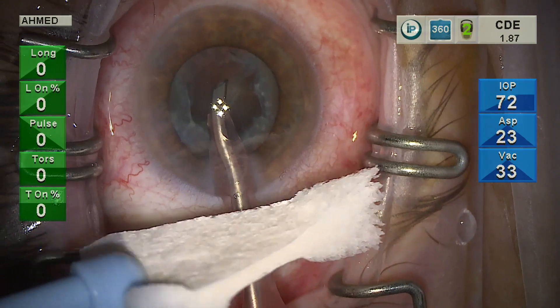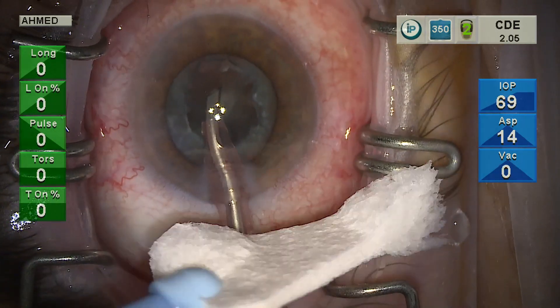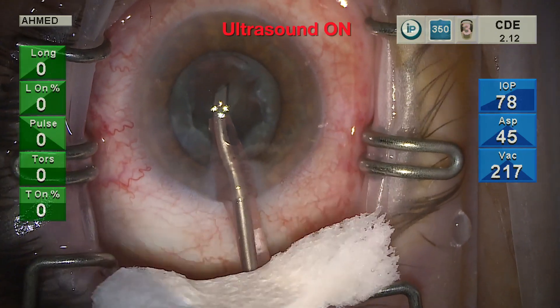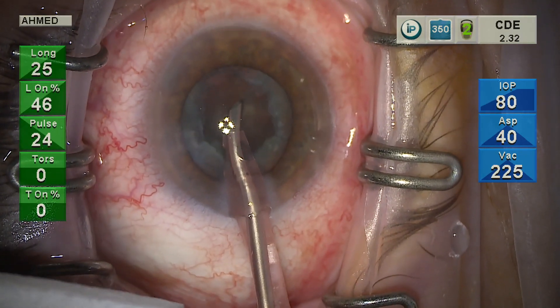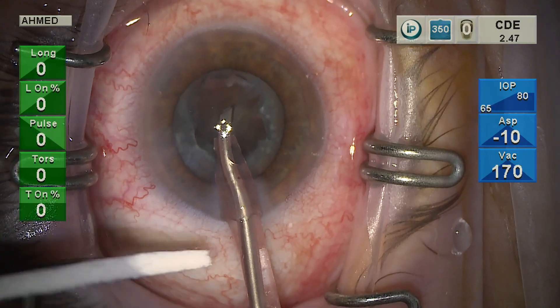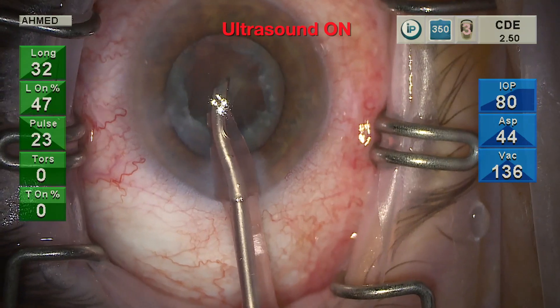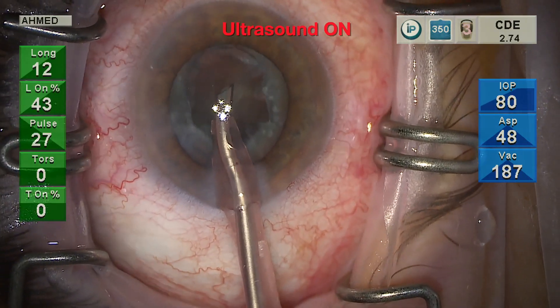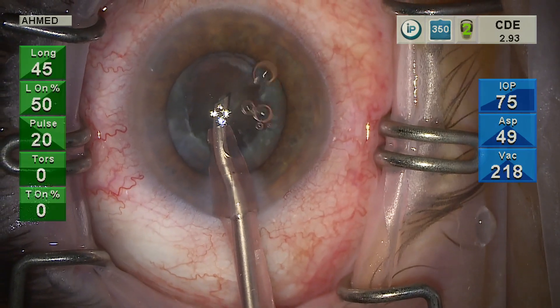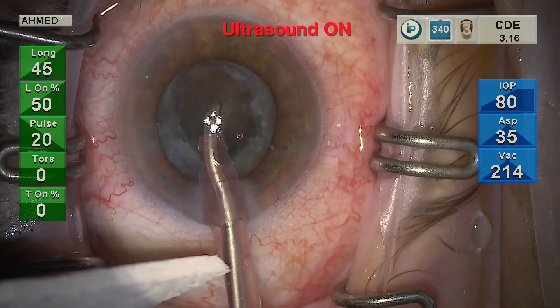This in vivo example shows periodically going back and forth between position zero, one, and then position three during phaco. Even holding a Weck-Cel near the incision, there really is no wetting of the Weck-Cel — no evidence of water formation or droplet formation. If there was aerosolization, we would expect to see some degree of wetting and some Weck-Cel uptake of the solution.